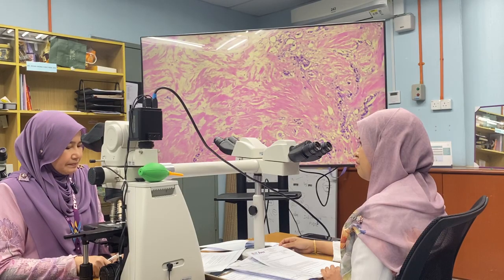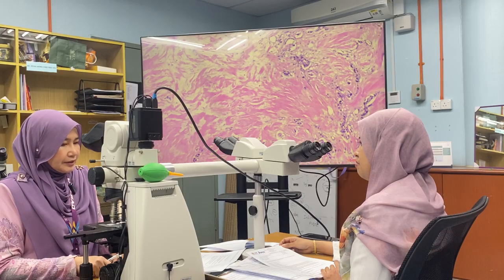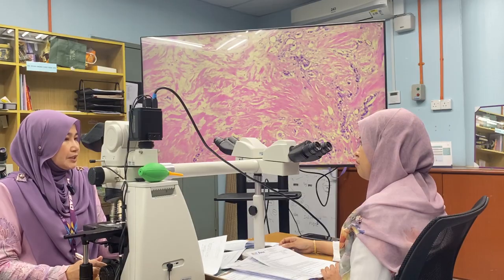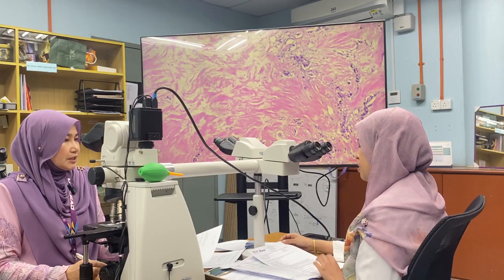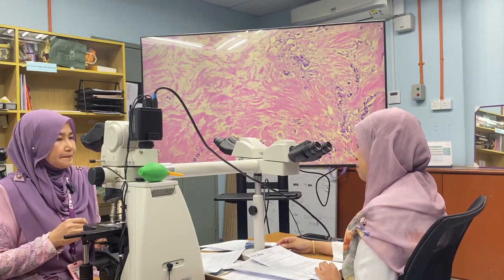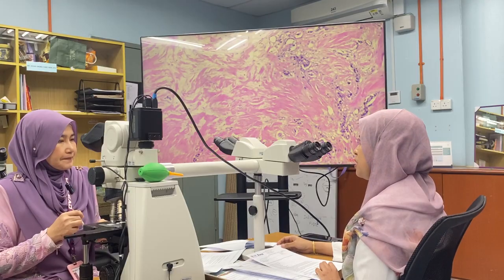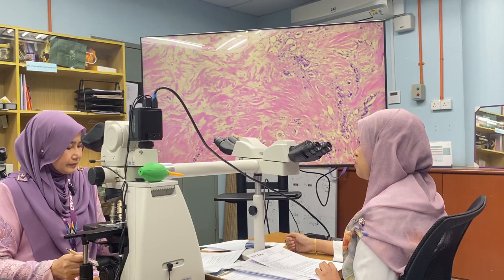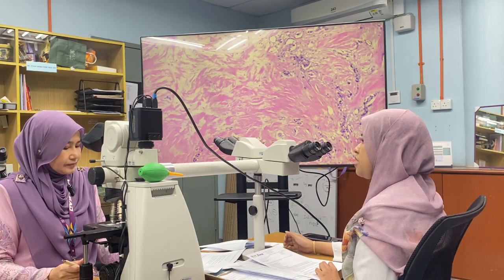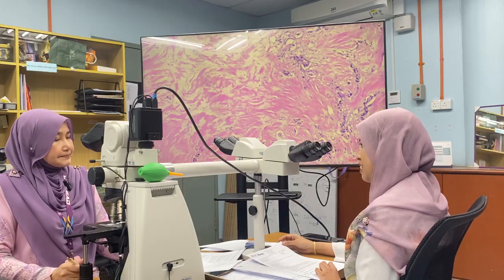What is actually the pathologist's role in the evaluation of the response to neoadjuvant chemotherapy? Our role is to aid the clinician in assessing the pathological response to the chemotherapy, because when we examine and also submit the specimen, we can assess the tumor response to the chemo by using the Miller-Payne regression grading.